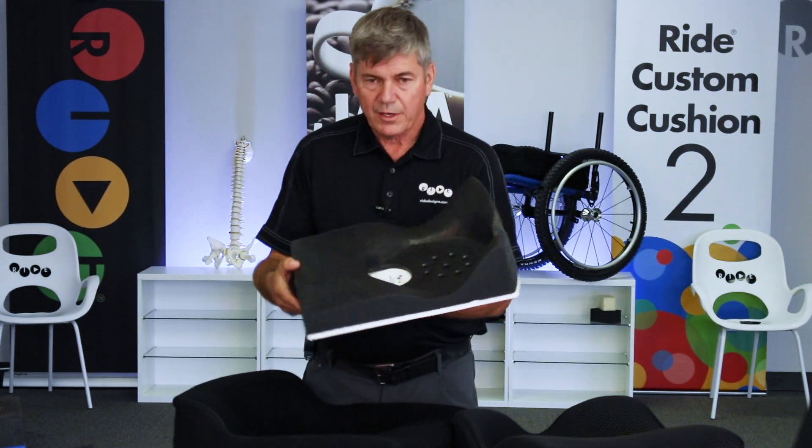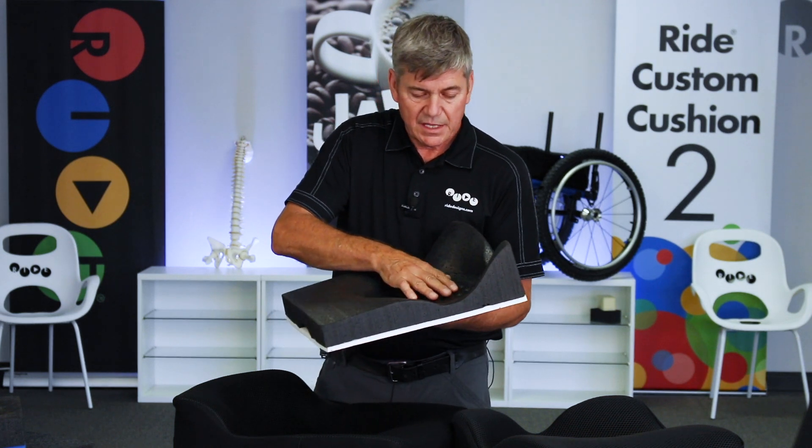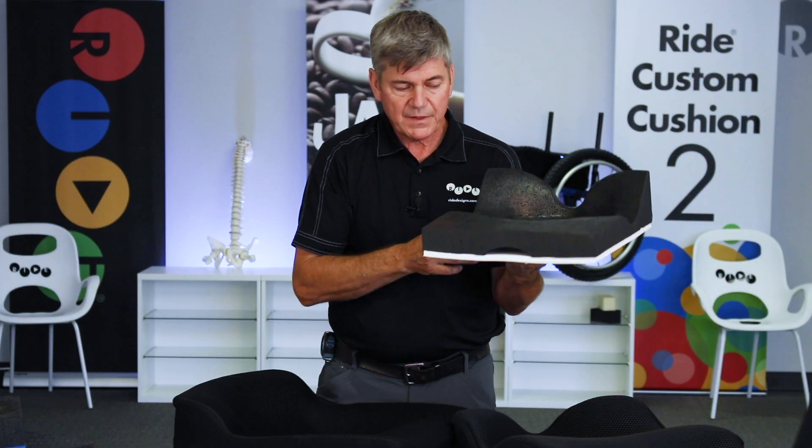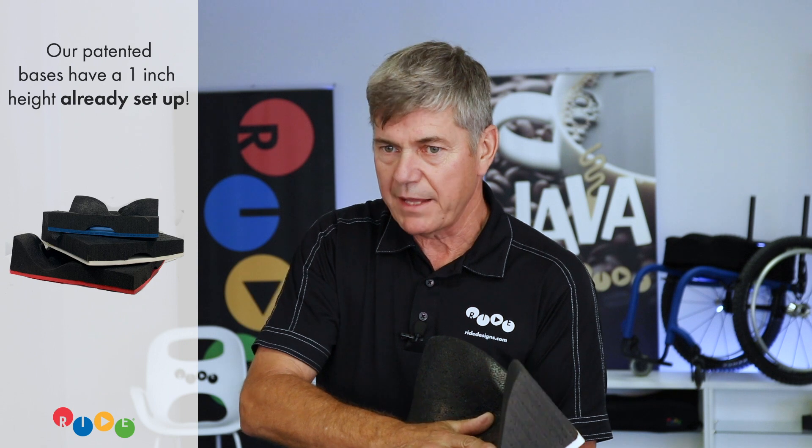Thick or tall cushions come from thick or tall shapes. In order to get a thin cushion, you need to have the person sitting down in the capture base. The goal is to capture the pelvis one inch off of the seating surface. That's already built into this base — you have a half inch of your orientation baseline, and also a half inch of black foam down in the bottom of the base. We automatically have that height set up in this patented base.